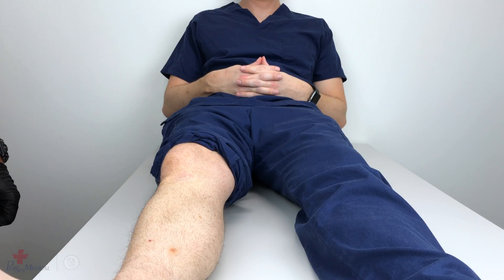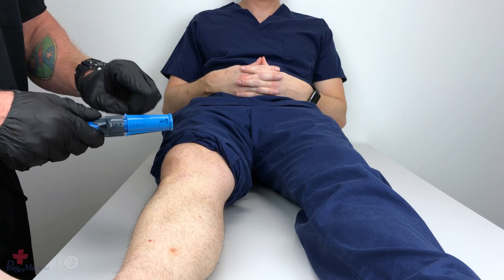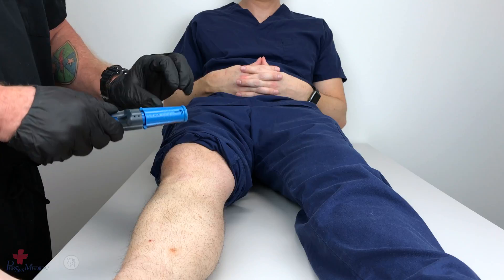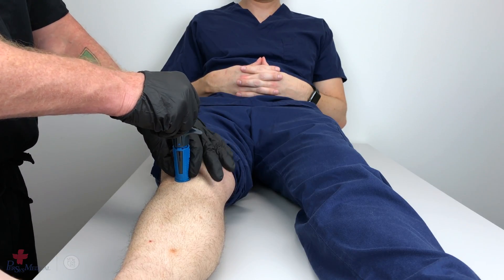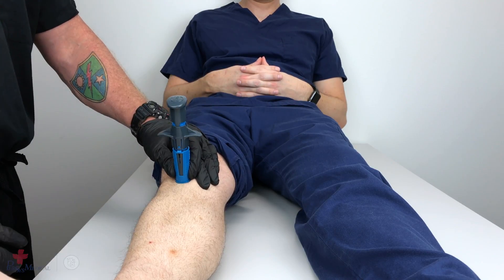Once you've properly located and prepped the site, grasp the neo by the textured dots, taking care to not put your fingers over the stabilizer locking tabs. Grasping at the textured dots, properly emplace the neo over the site, using the palm and fingers of that hand to stabilize the neo in place.